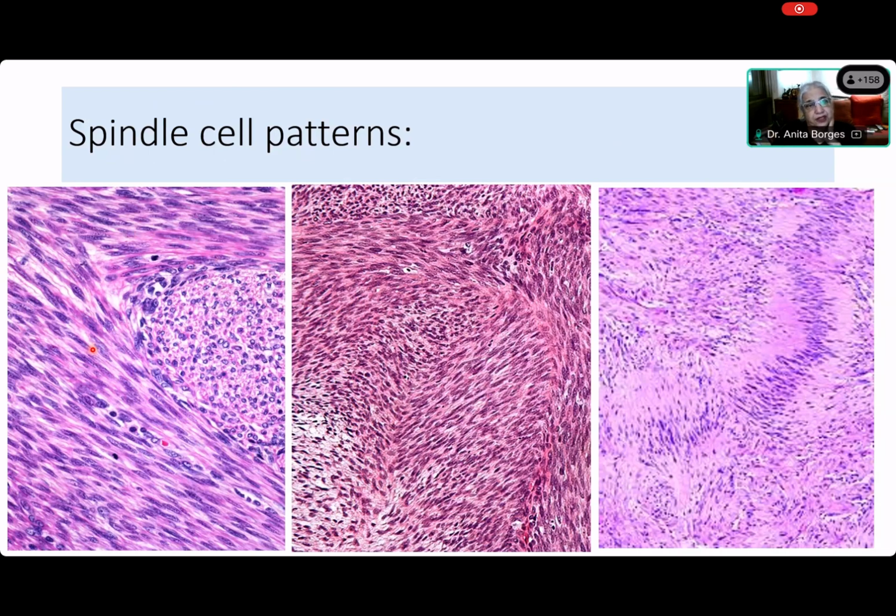The definition of a fascicle is you see spindle cells, and you can see them all here, all running together as a bundle. Here that bundle has been cut transversely, but otherwise they're all running in a bundle parallel to one another, and each of them is running parallel to the direction in which that bundle is running. So if I have to show it to you, here you are. This is the direction where you see that big black arrow in which that bundle is running. You could say it is running in the opposite direction, it doesn't matter, but the bundle is there, and you can see that all these cells are spindle cells.